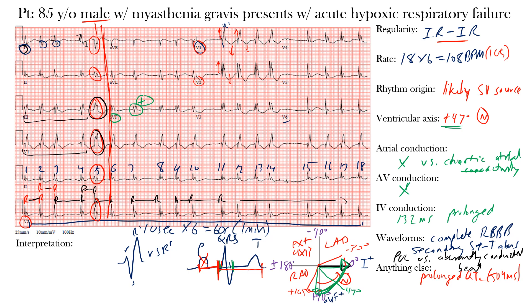Regarding R wave progression in the precordial leads: normally R wave amplitude should progressively increase from V1 through V5. However, with this abnormal conduction from the right bundle branch block, it's not always the most useful finding. Similarly, the transitional zone is highly dependent on lead placement, so keep that in mind when interpreting other EKGs.